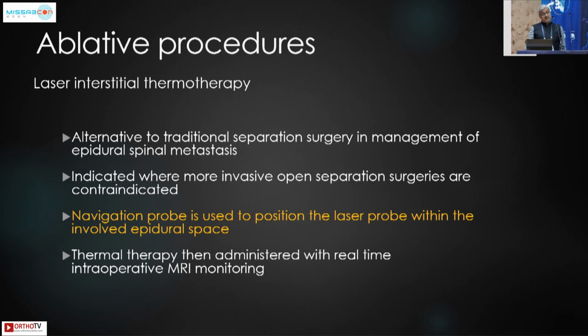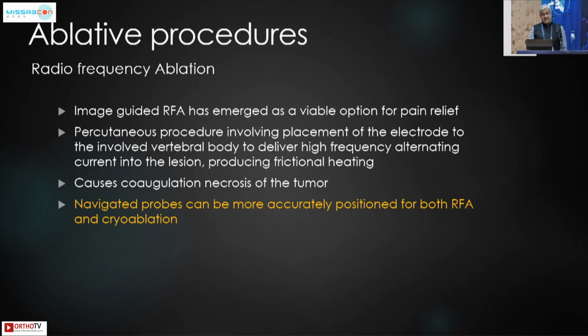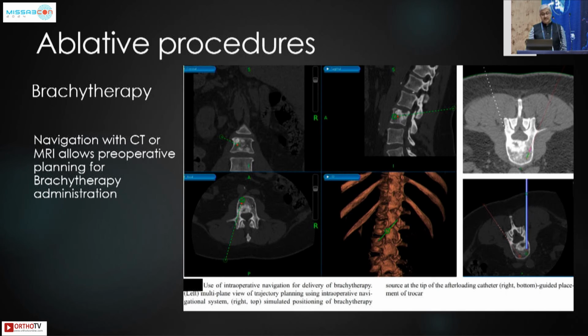It can also be useful with ablative procedures like laser interstitial thermotherapy and radiofrequency ablation, where the navigated probes can be more accurately positioned for both radiofrequency ablation and cryoablation. And also useful in brachytherapy, where navigation with CT and MRI can be used to exactly target the lesion in difficult areas before the brachytherapy administration.